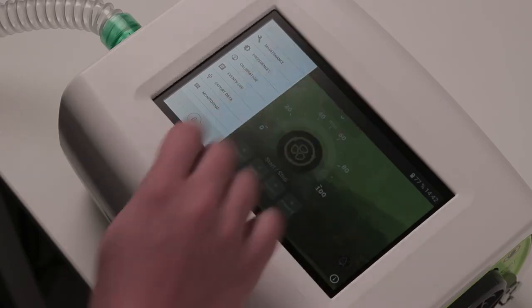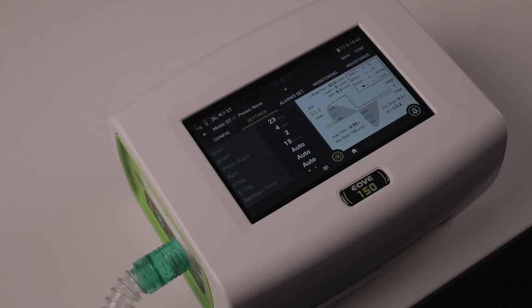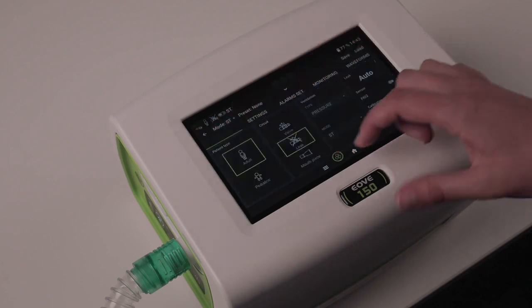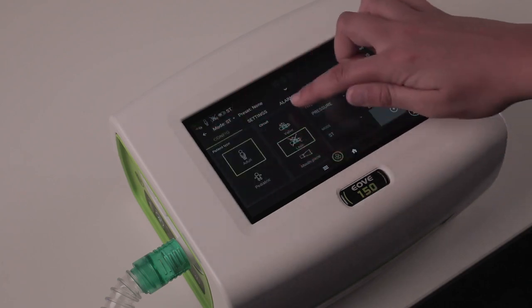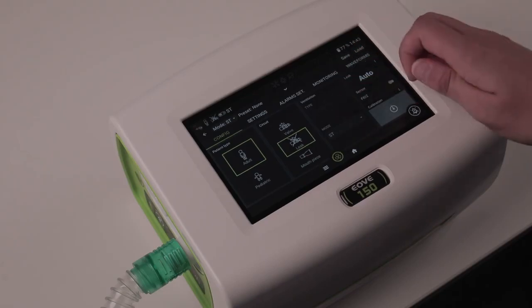You now have access to the settings via the clinical menu. On the configuration tab, select the patient type, the patient circuit type, and the type of ventilation, pressure or volume, and the ventilation mode.